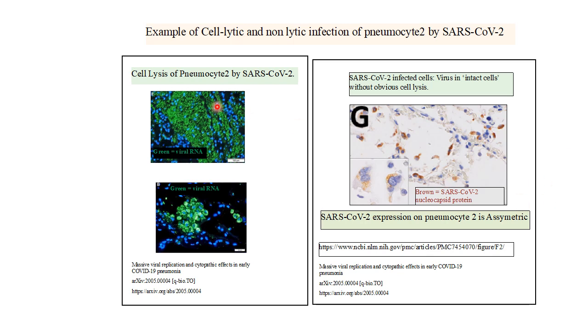This slide in a bit more detail. Cell lysis here. Look at these cells. They are about to lyse. These cells have lysed here already. These cells are weakened, and they will lyse soon. And some more already happened. Cell lysis here. Remember this slide. Cells are reasonably healthy and positive for viral nucleoprotein.